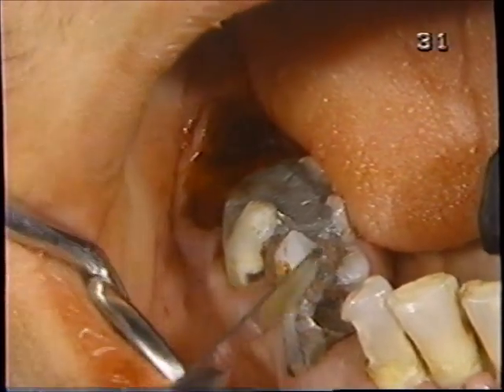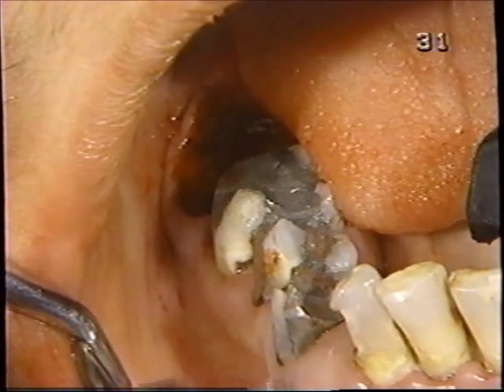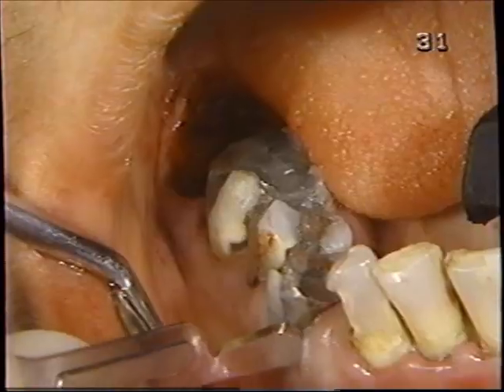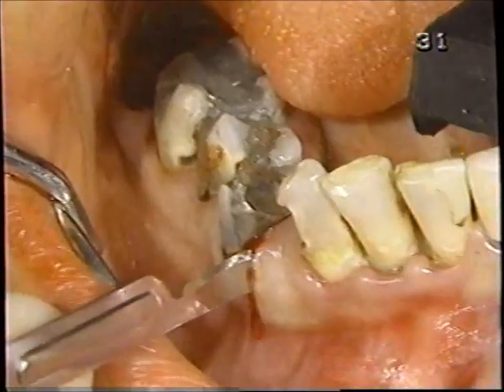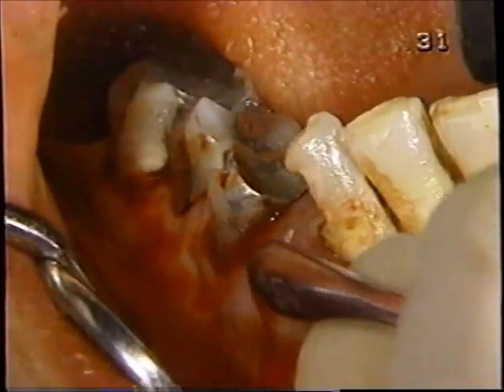So just to plan for what might happen in a few minutes, we're going to make the release incision on the mesial of number 28 and then reflect on back. We see the release incision on the mesial of number 28.